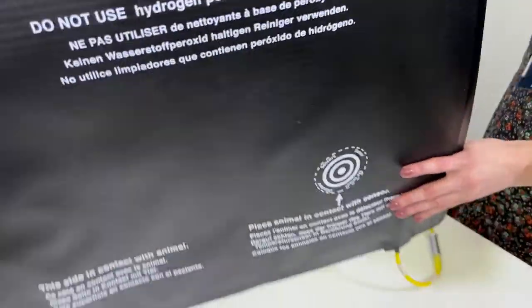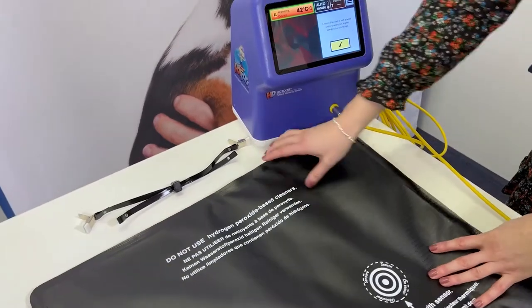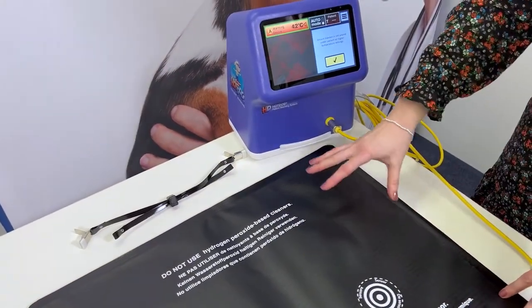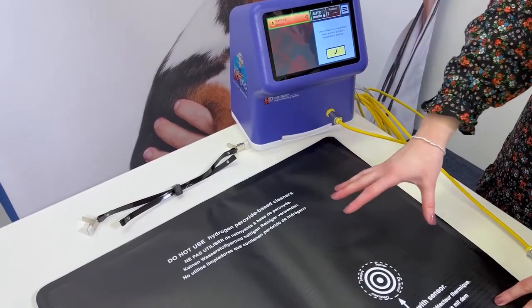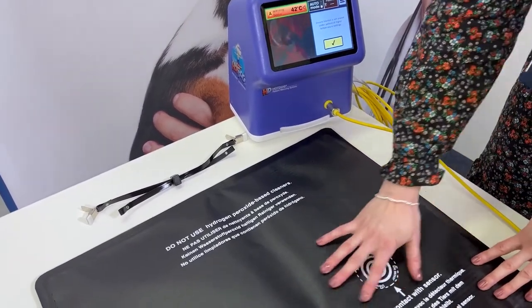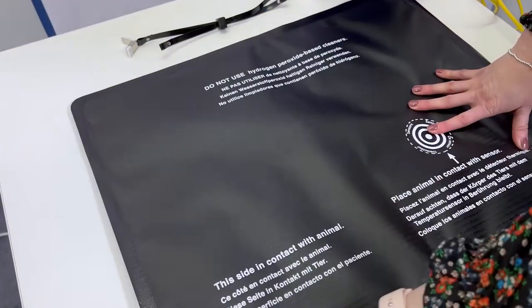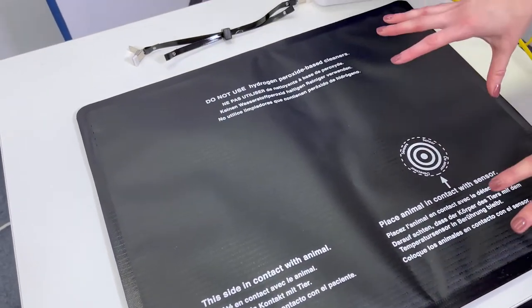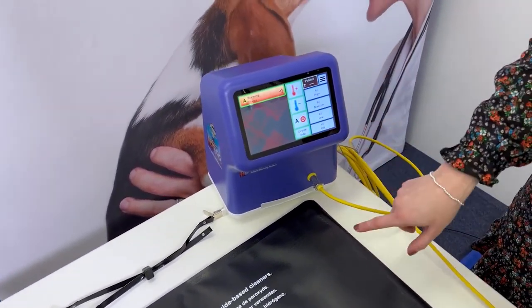The 42-degree setting is only for when the patient is under the blanket, not on top of it. There doesn't need to be any barrier between the patient and the blanket — you don't need to put a fleece blanket on there; the manufacturer's instructions don't recommend that. They can make full contact with the pad. If you'd like to make a hot dog with your patient, just make sure you have the safe temperature — bring it back down to 40 degrees.